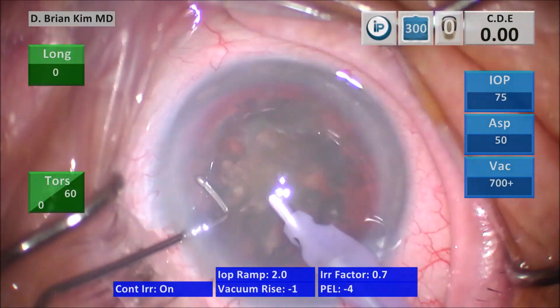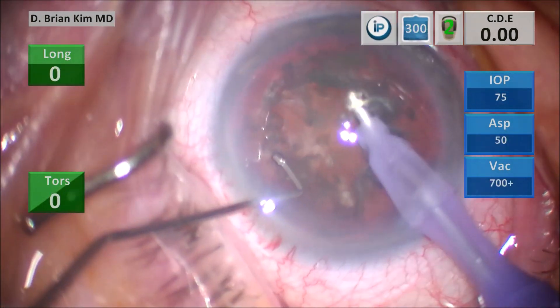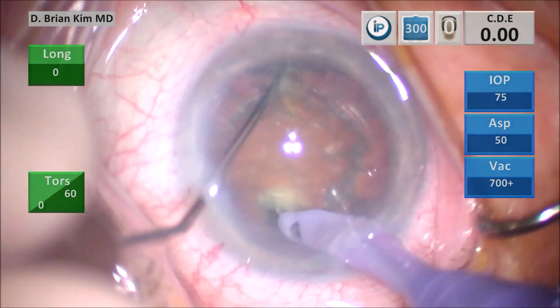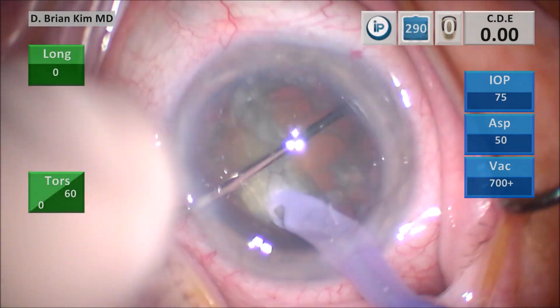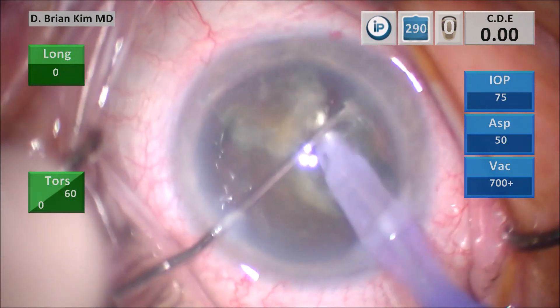I remove the surface epinuclear material and then I begin the double chop maneuver. I place the chopper out underneath the epinuclear ridge, go out to the fornix with the chopper, go sub-incisionally with the phacotip, bring both instruments together and it crushes the lens in half. I place the chopper out to the contralateral equator and that crushes the right hemi-nucleus — that is the cross chop maneuver.